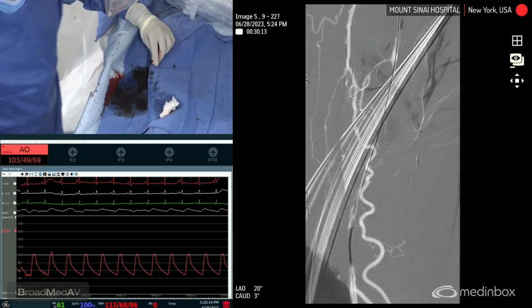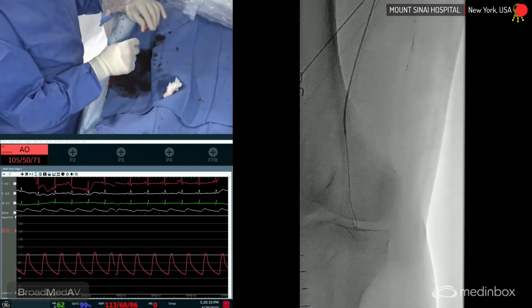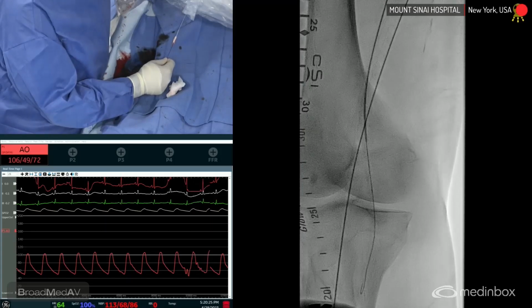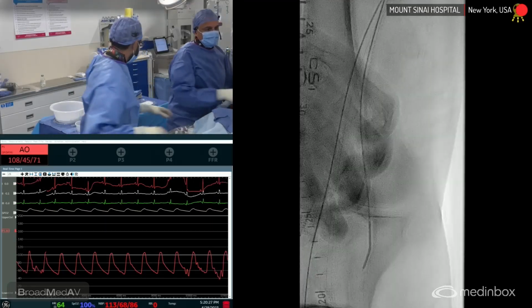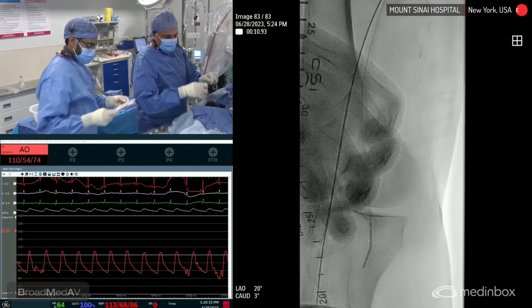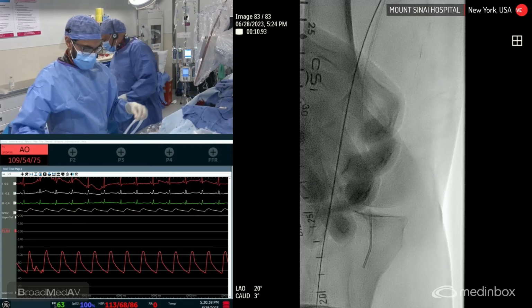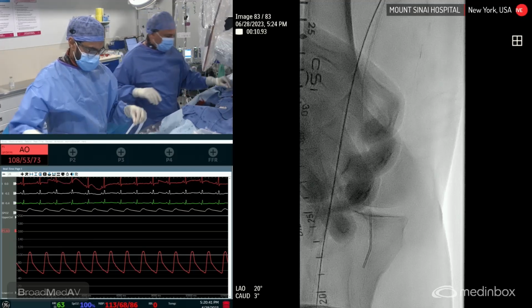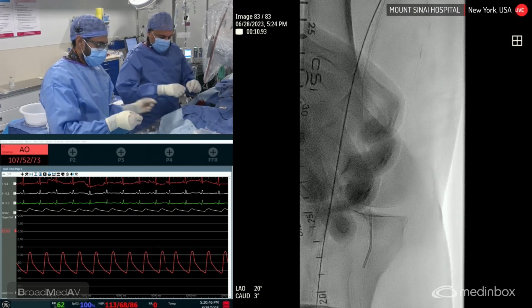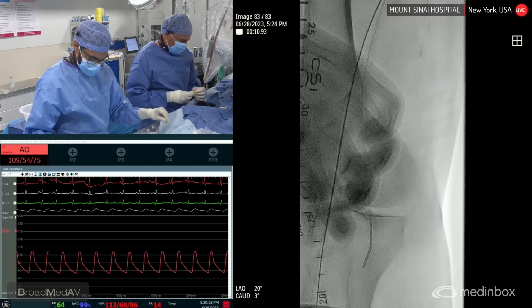So we just crossed the lesion. Show me down now. You can see we're in the lesion. We're across the lesion now. So what we're planning on doing is putting a filter down. The reason we're using a filter is our vessel runoff is very, very poor because we have a peroneal lesion, and we also have this slow flow in the vessel. So I'm just going to go ahead and take this wire, which is the 18, the bare wire, which is the wire that comes with Abbott.